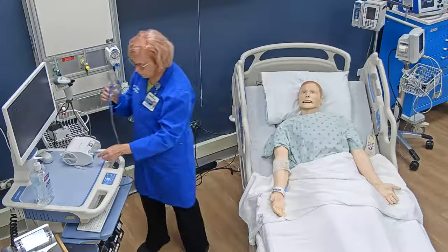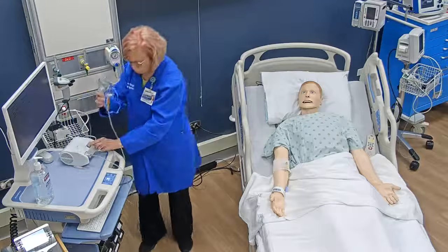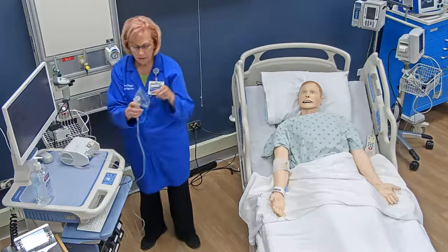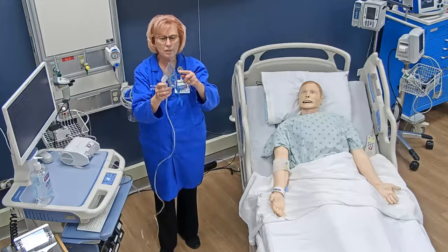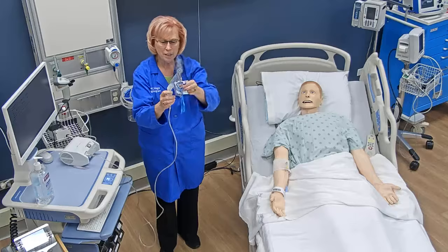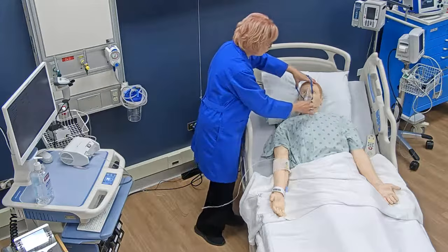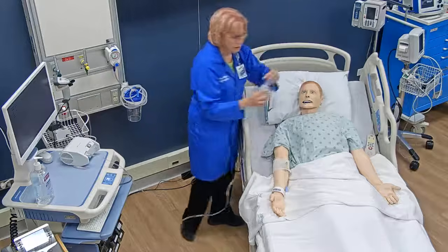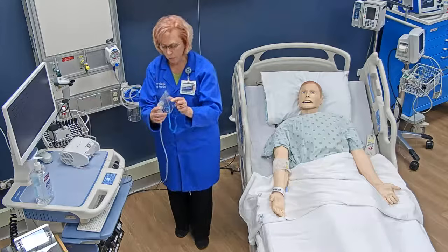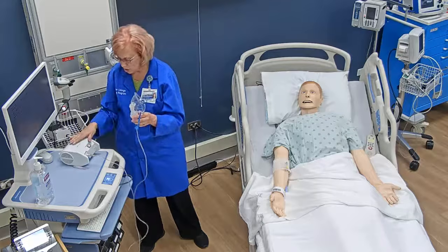With this machine, you hook your tubing here and you turn the machine on. As soon as you see the medicine, the fog basically of the medicine, then it is ready for you to put onto your patient's face. So this is one option for giving the nebulized medication, is to use this machine.